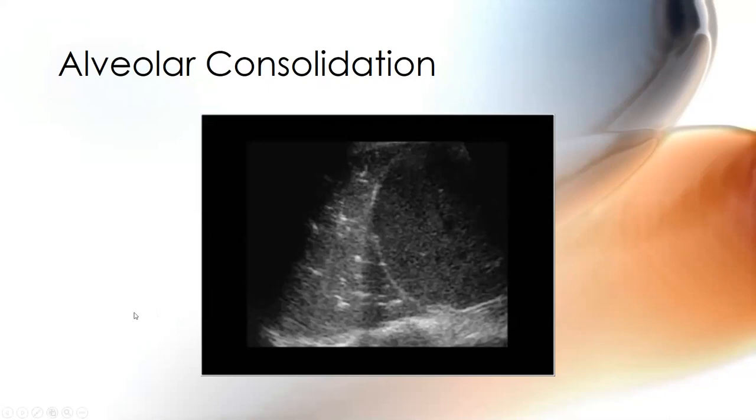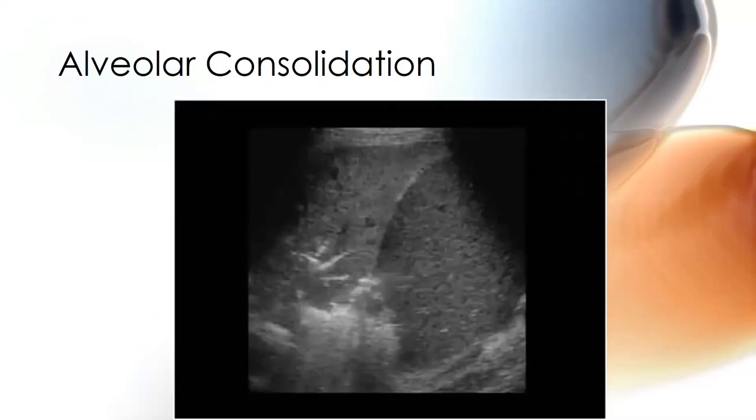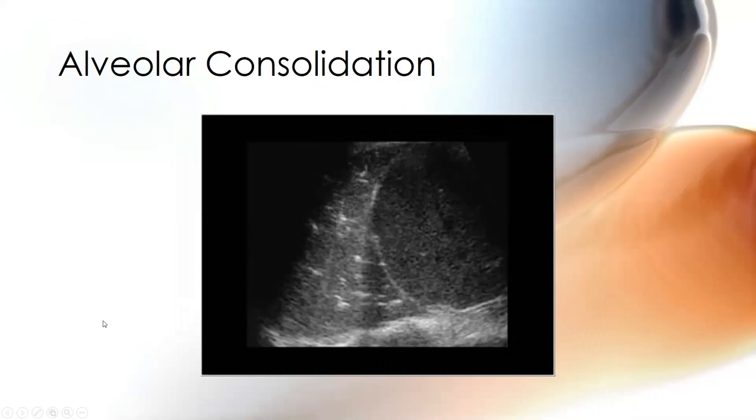To Robbie, there are more air bronchograms in this image than in this image. Both of these views are separating left from right, so this is going to be a sagittal image, not transverse. But that's a good attempt at an observation of how I'm holding the probe. If you hold the probe the same way every single time, then all your images should look very, very similar. Robbie pointed out, there are air bronchograms all the way up anteriorly and all the way down.